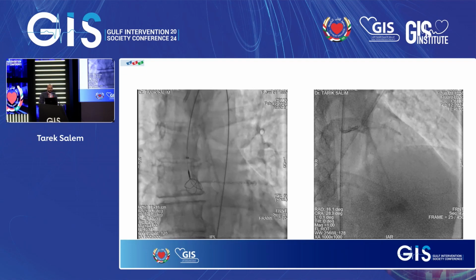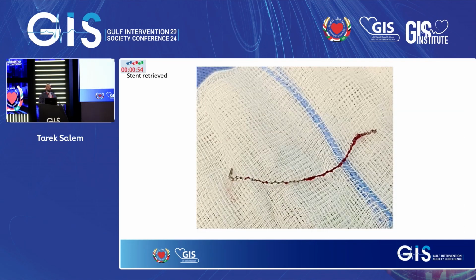Okay, and this is my stent. Now, to be honest, at this stage, I must say, and we have to appreciate that, we can get operator exhaustion. It's a thing. I was exhausted, and I was not keen to actually go to the left side and try to retrieve it. I spoke to my surgeon, who did it within less than 2 minutes under local anesthetic and sedation, and he took the stent back. As you can see, the stent is elongated and damaged.